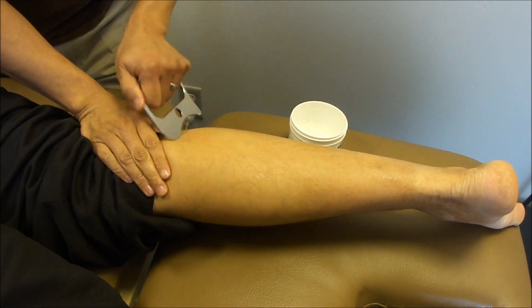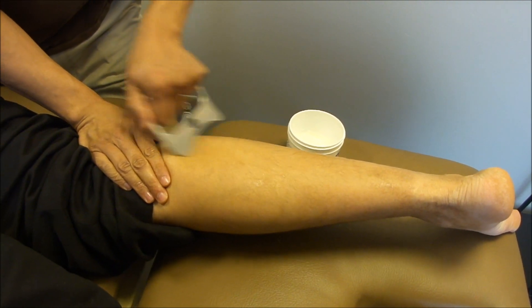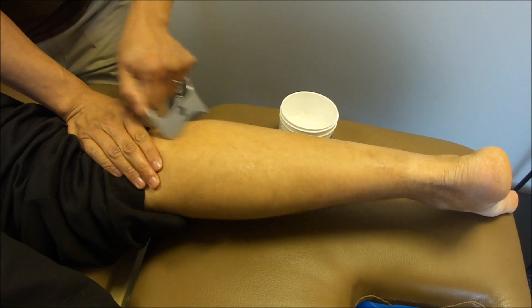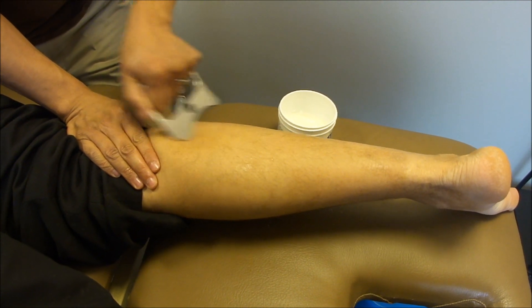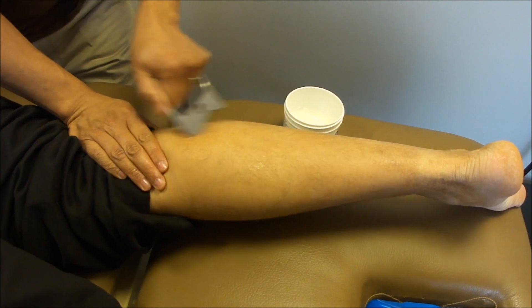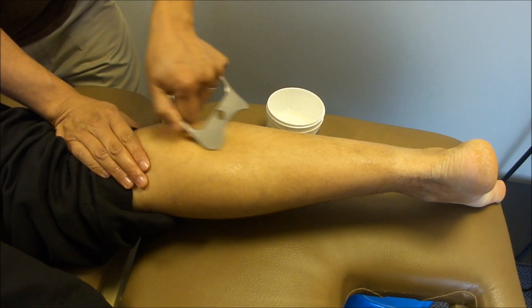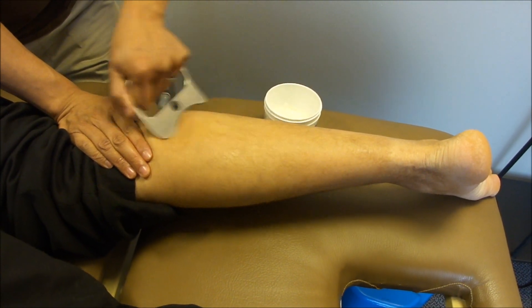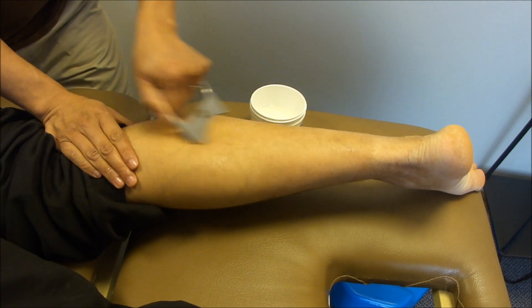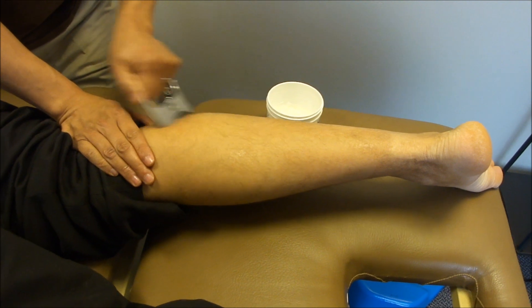Then flip over to progress in depth. Before we get to the mobilization with movement — though this treatment is not as long as it should be — I would normally do more around the fibular head and this area, probably about ten minutes in total at most for this small area, combining both treatment regions.